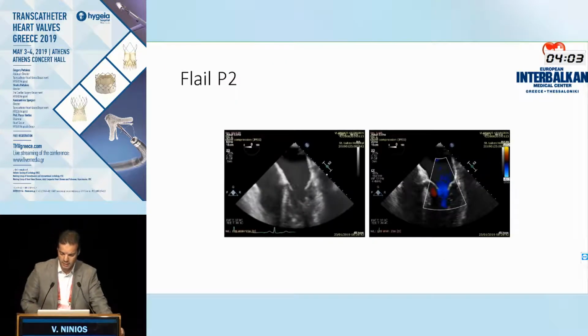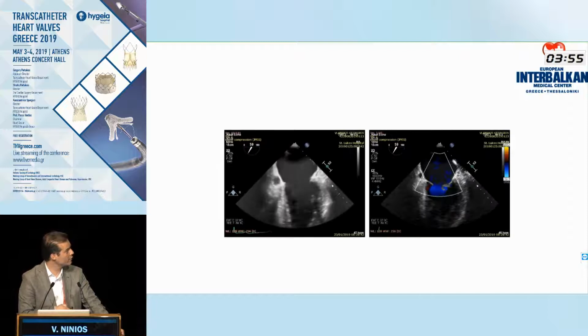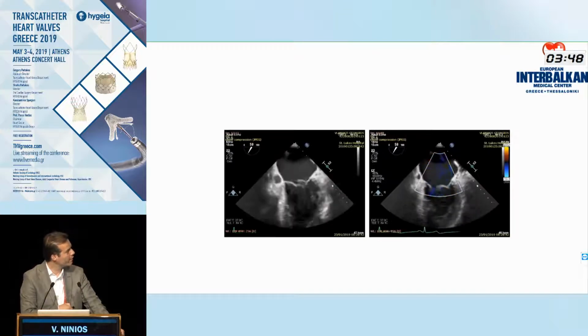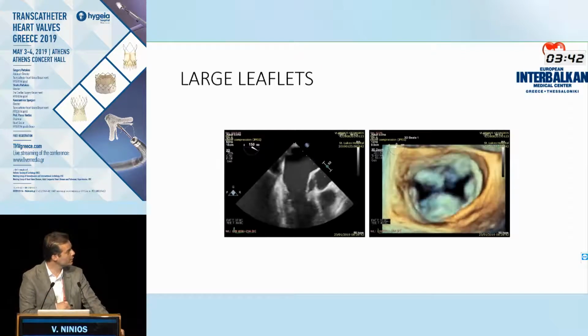This is a case that we did recently, a patient with a flail P2, long leaflet. You can see it's a very long leaflet. But long is one aspect of the problem. There are 2 more aspects: the width, the height of the prolapse, and also how far back the prolapse goes into the annulus, because the lack of secondary chordal support is also pivotal.